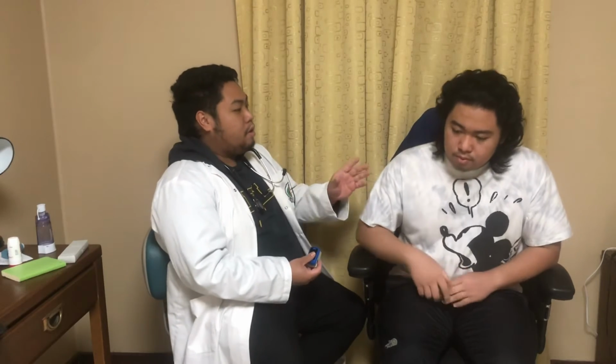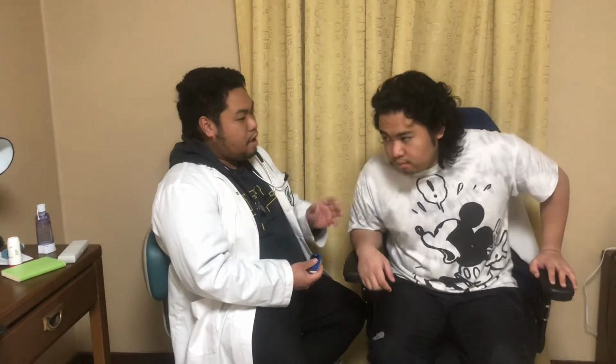After this procedure, we're going to reassess our patient again with their vital signs to see any improvements in their lung capacity after the bronchodilator or the MDI administration. So sir, we're going to be checking your heart rate, your lung sounds, and your respiratory rate again, and also your PEFR.